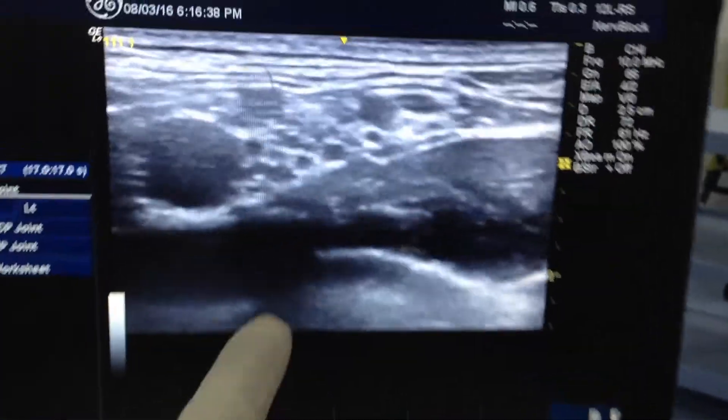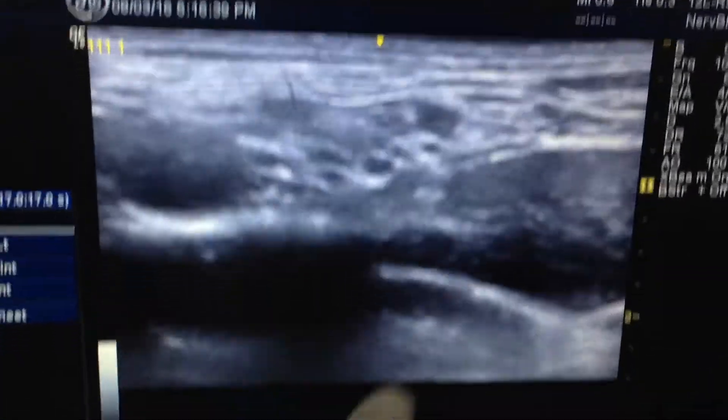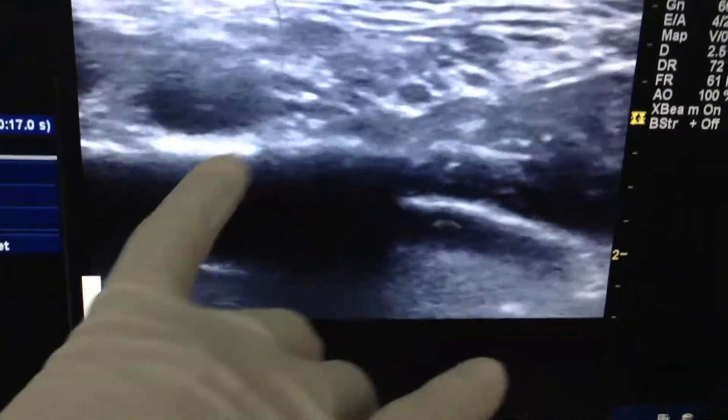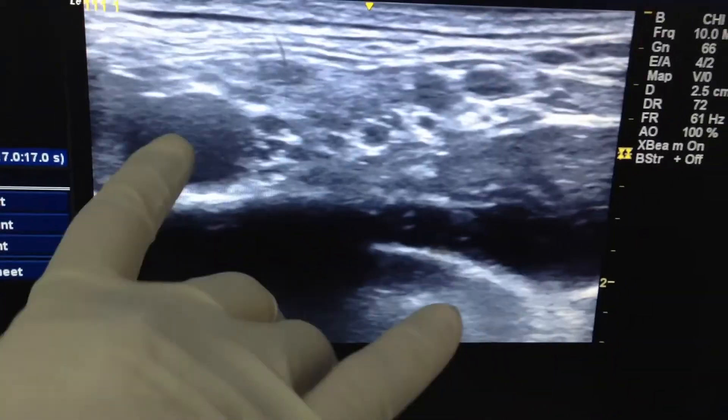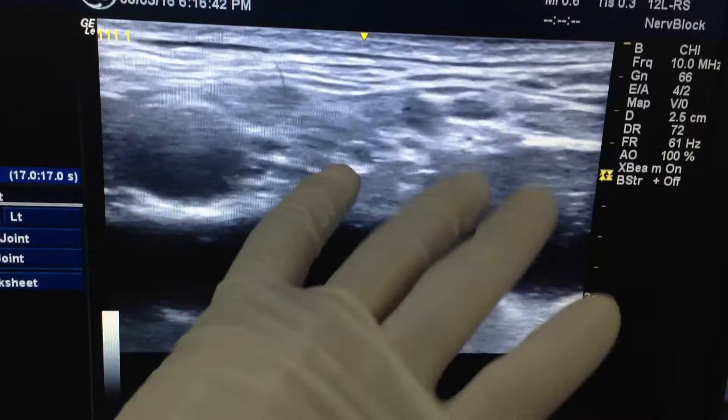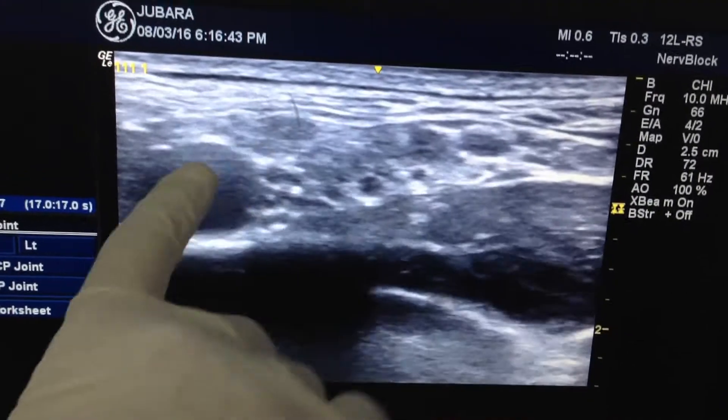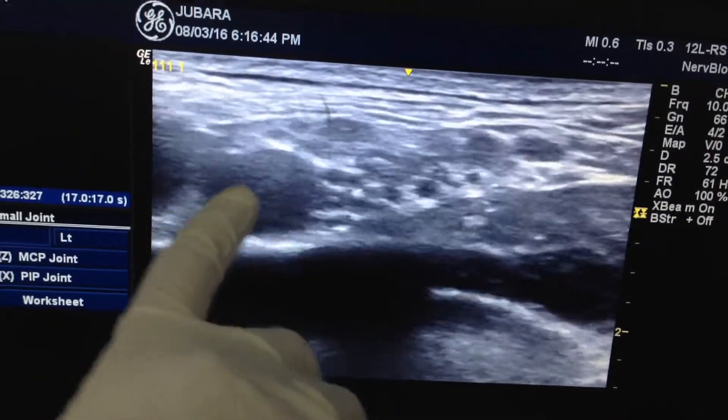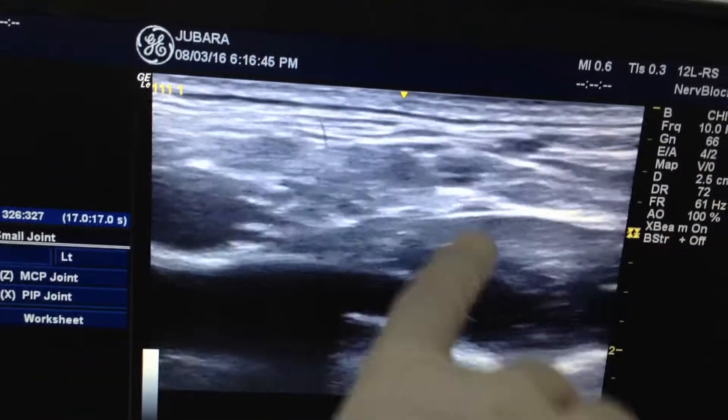This is the supraclavicular fossa, this is the first rib, this is the brachial plexus, and this is the subclavian artery.